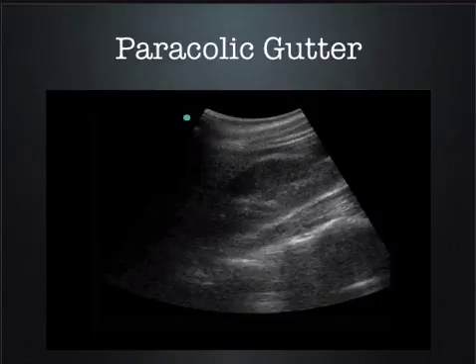All right, don't forget to look at the inferior pole of the kidney. The inferior pole of the kidney is another potential space. This is why we can pick up smaller amounts of fluids than you do. It's negative here, but it's positive here. Why is it positive there?